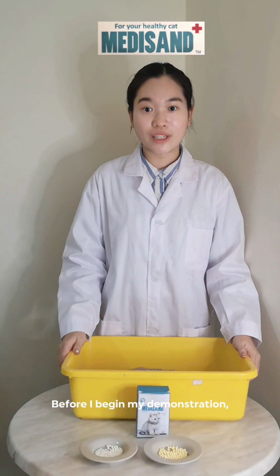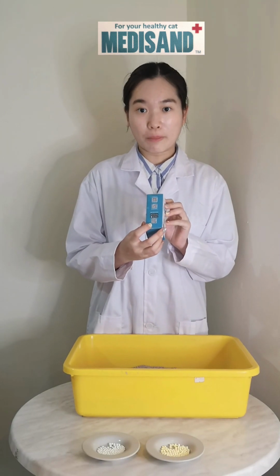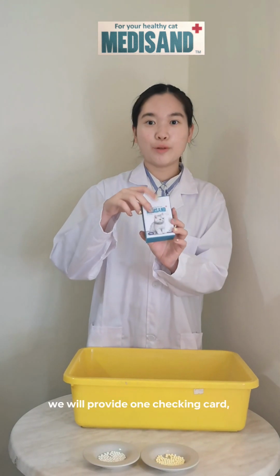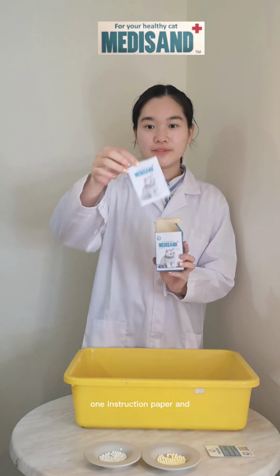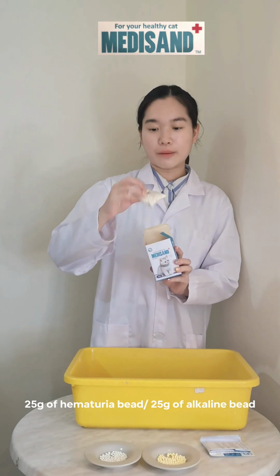Before I begin my demonstration, users of Medisand will have to scan this QR code on our packaging to download the Medisand app for detection of the beads level. Inside our Medisand box, we will provide one checking card, one instruction paper, and 25 grams of hematuria beads.